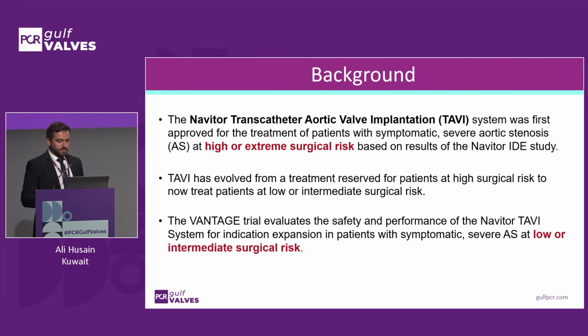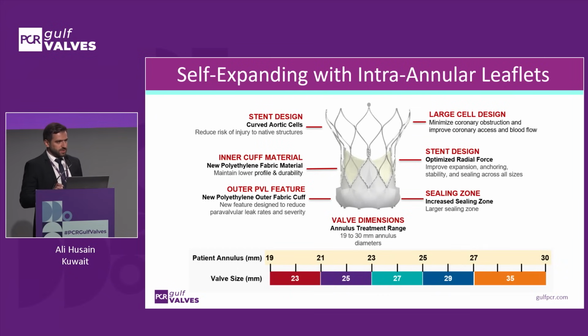So it was aimed to evaluate the safety as well as the performance of the Navitor system in patients with severe symptomatic aortic stenosis who are really at low or intermediate surgical risk. So this is the design of the Navitor valve. It's a very unique design, a self-expandable valve, but with intra-annular leaflets.